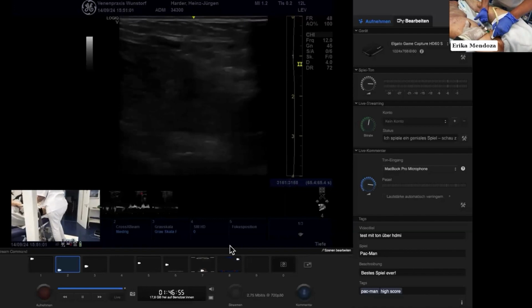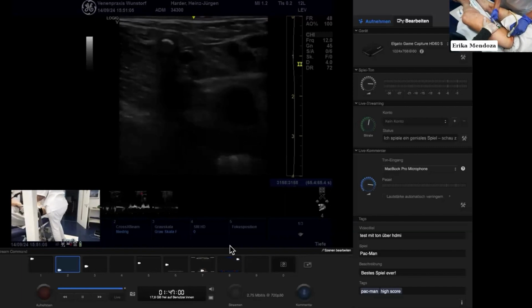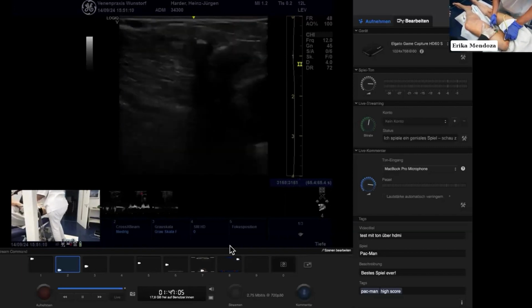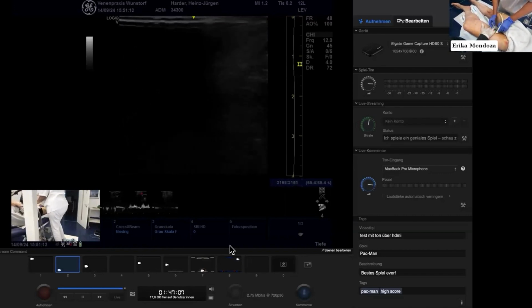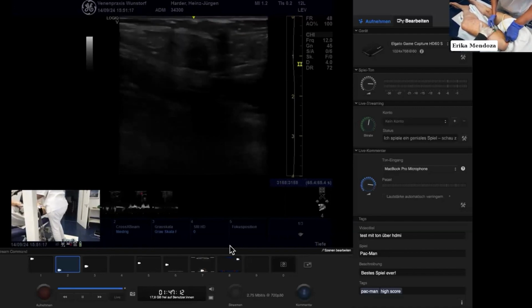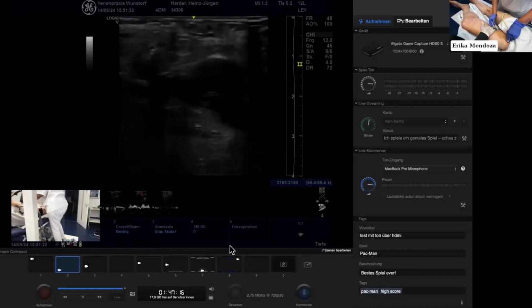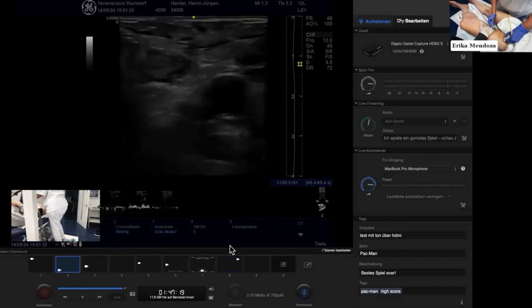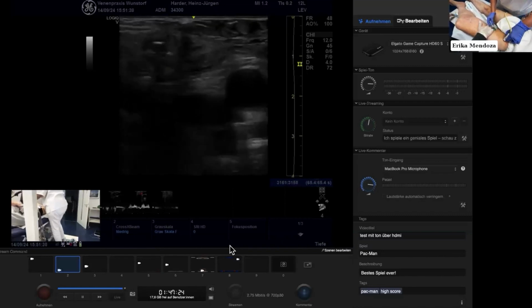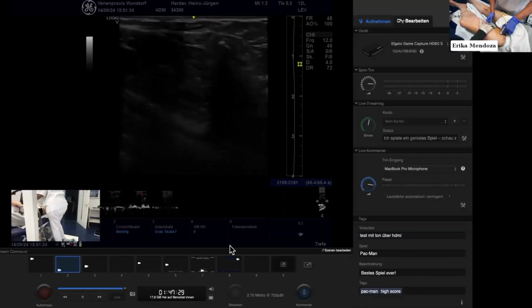So now my assistant is closing the distal GSV. Yes. Obliging the thing I am injecting to go to the head. She's closing this here with the digits, and I can show you that the volume has gone to the saphenofemoral junction perfectly. Of course, in the femoral vein, you see a little bit of it. Was it able to be seen? No, not so much. Excellent. It's just until the junction.